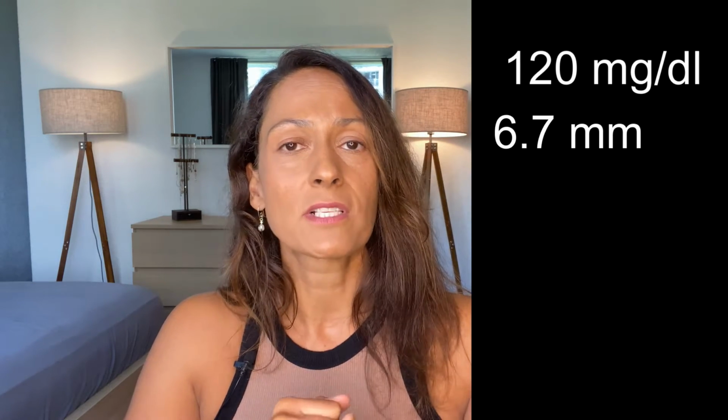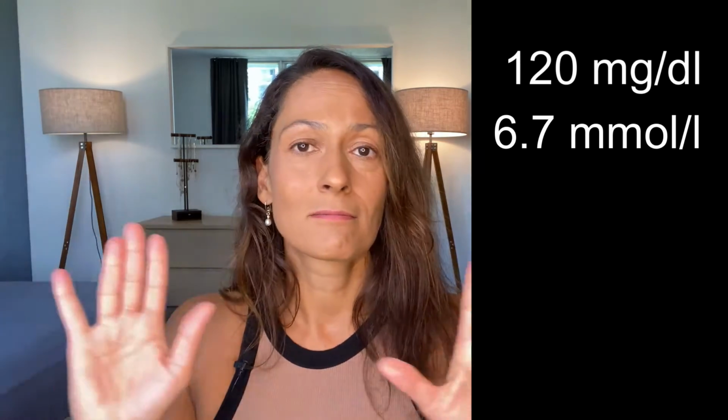So let me give you an example, just because I think that makes it a little bit more real. So let's say that I just woke up. So it's morning, I haven't injected any rapid-acting insulin in the last 4+ hours because I've been sleeping. My blood sugar is 120 milligrams per deciliter, that's 6.7 millimole per liter, which is fairly good blood sugar for me. That's where I like to wake up.